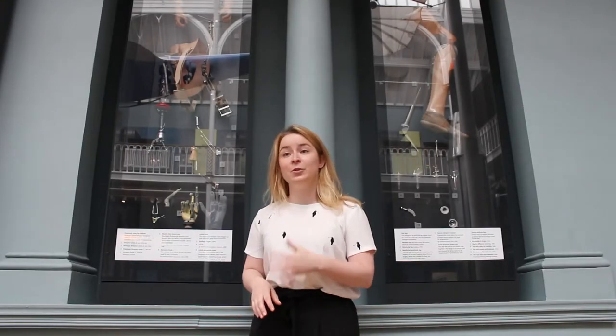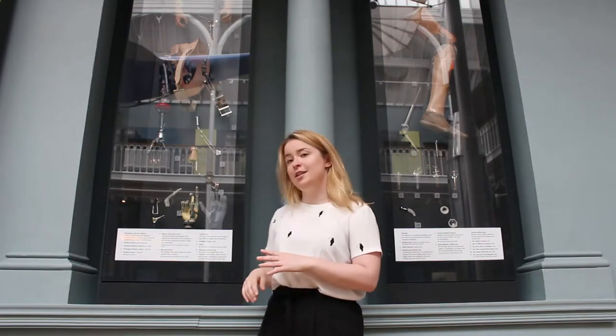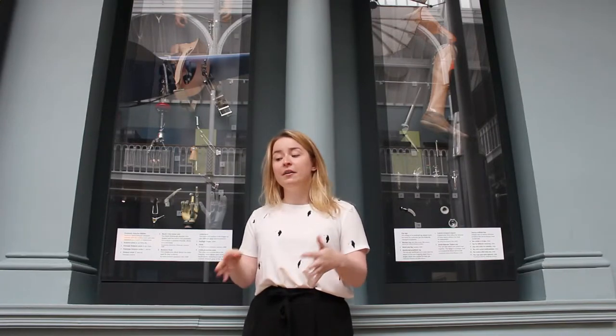We're standing in front of a case full of prosthetic arms, the majority of which were made within miles of where we're currently standing here in Edinburgh. At the top of the case is a set of arms designed by David Simpson, made for children affected by thalidomide. Before that, there was no unit in Edinburgh to treat children who had limb loss or residual limbs from birth. After thalidomide, there was quite a lot of funding here in Edinburgh for prosthetic arms, and it became a leader in childhood prosthetics throughout Europe.